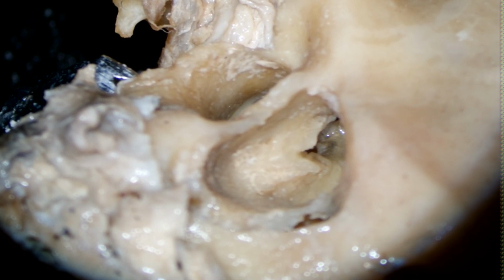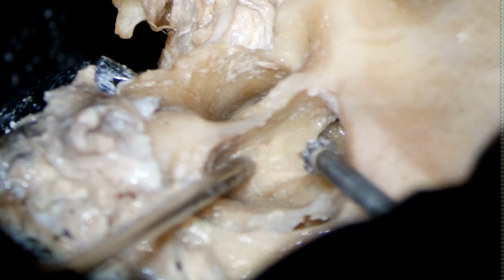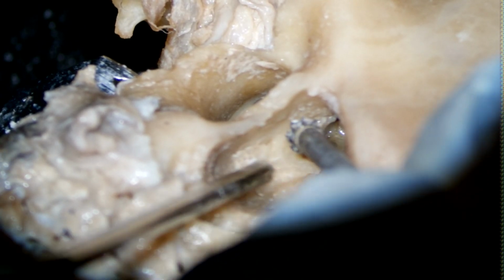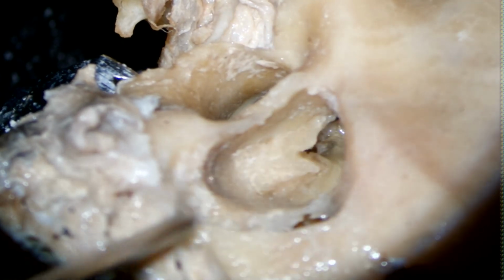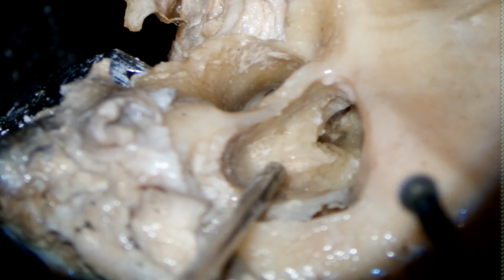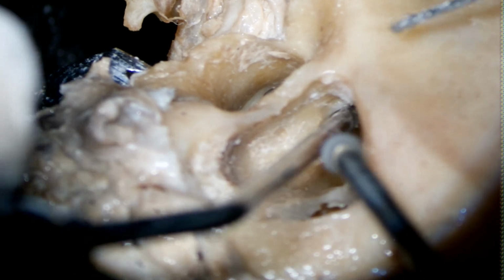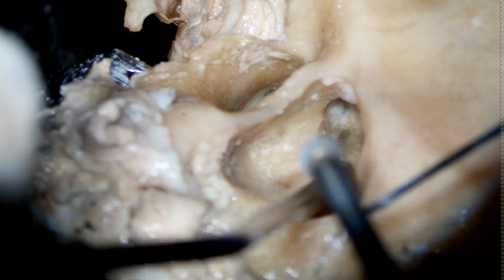So incus is a very important landmark, and when you are drilling, you should see the direction of the short process of the incus, right? Okay, so that will point towards the facial nerve.